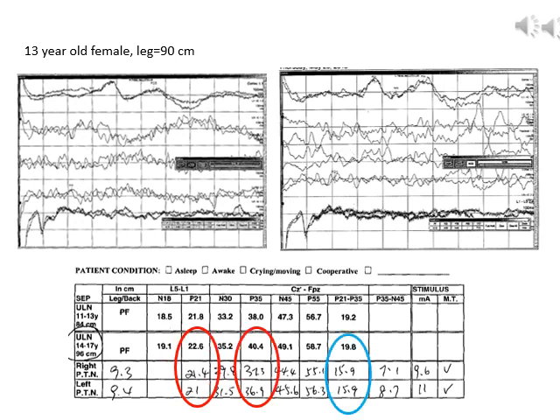And why it's helpful to try to identify a P21 is that having a P21 latency gives us an interpeak latency between the P21 and P35, which is the lumbar response traveling to the cortex. And so that gives us a measure of central conduction through the spine, brainstem to the cortex. And so it's very helpful to try and find the P21 and the P35.